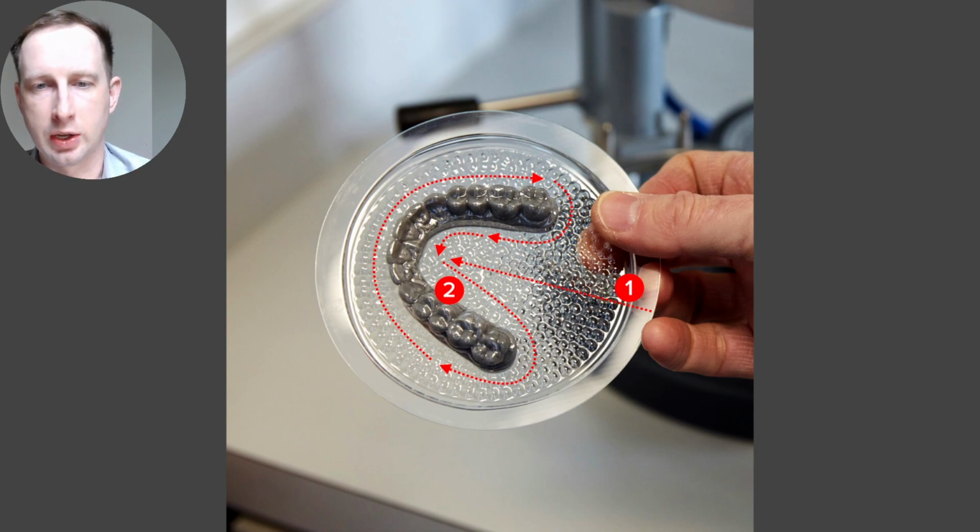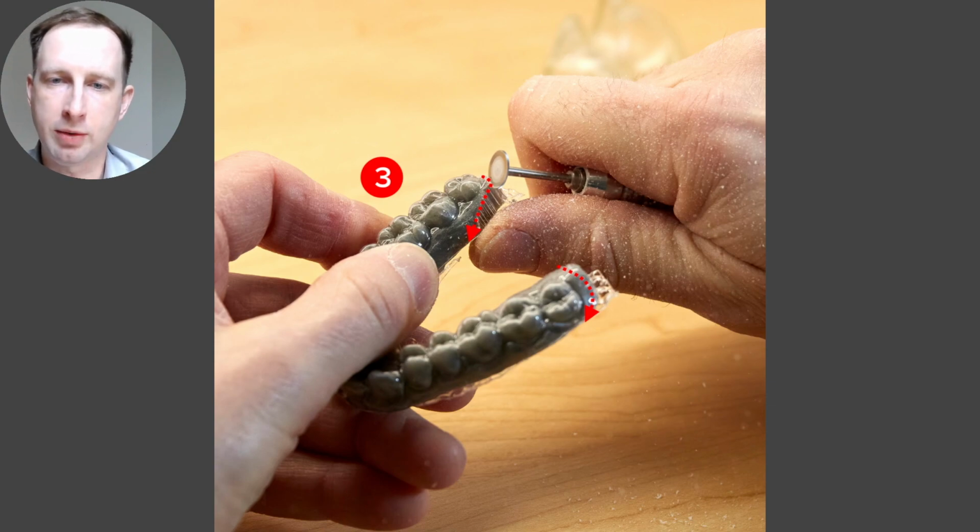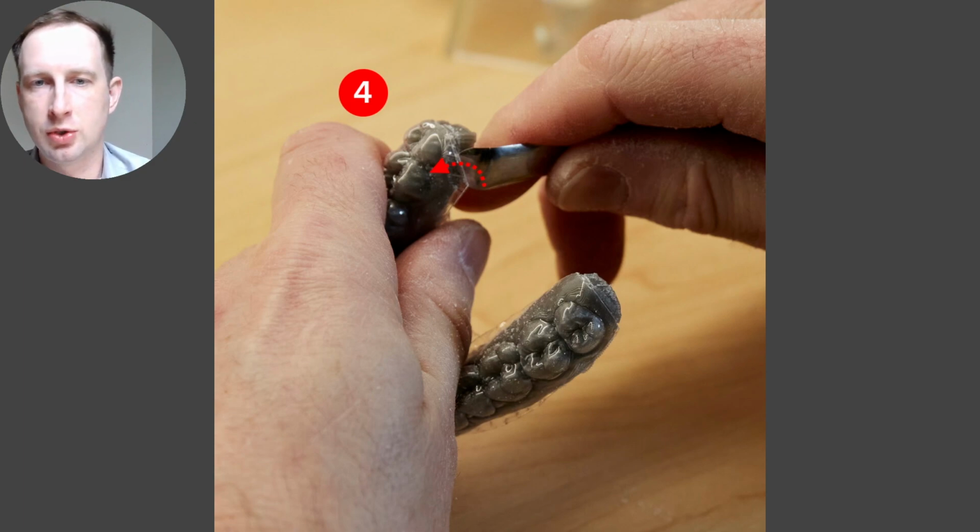I like to take a sturdy pair of scissors, make an initial cut in towards the lingual side of the arch, as you see in 1, then make a rough cut where you see on 2 with those same scissors. And you can see this is an example of a pair of scissors or shears that are a little bit beefier, just for these rough cuts. Then once you have the rough cut, on the rearmost molars, you trim almost like a U around the backside, not cutting the anatomy, but it's really giving you a pry point to get the appliance off the model. You trim that with a cutting disc or wheel, low speed handpiece, even a high speed would work, of course, and then use almost like this little shoehorn to pop the appliance off of the model.